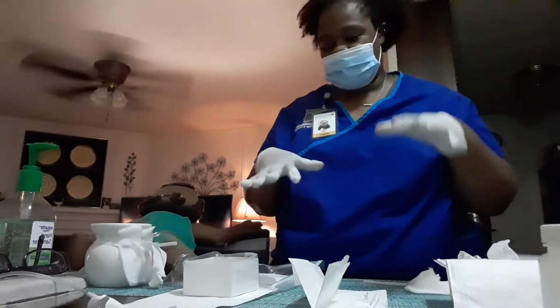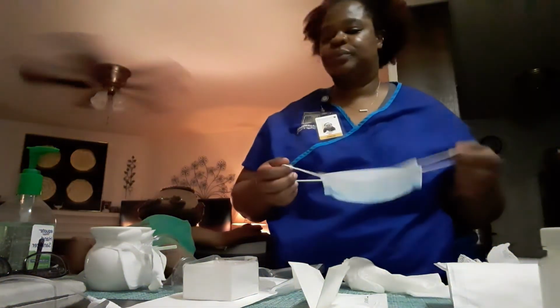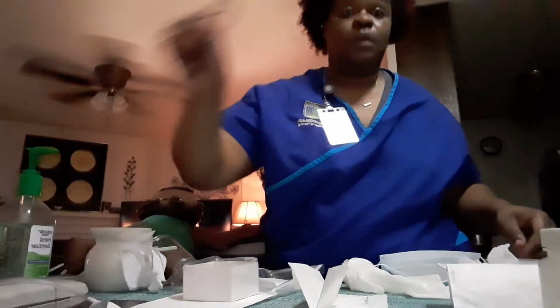I'm going to discard my supplies. I would take off my gloves. Remove my face mask. I would remove my eyewear. I will perform hand hygiene.